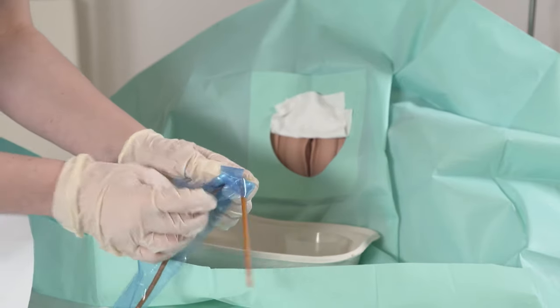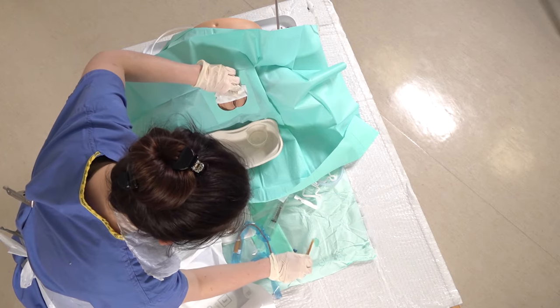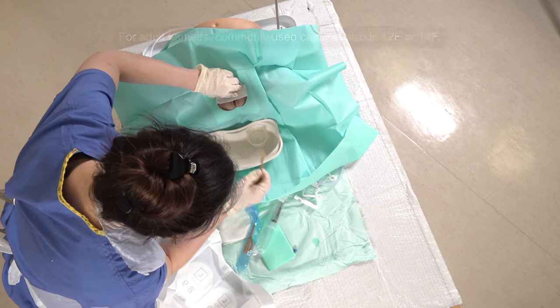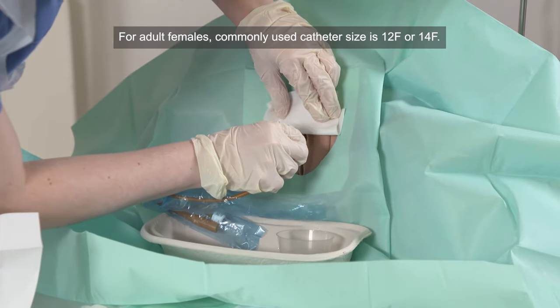So opening the tip up, just dipping that in the leftover instillagel, and then you can insert the catheter into the urethra.